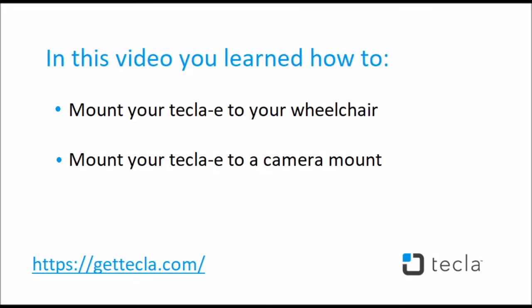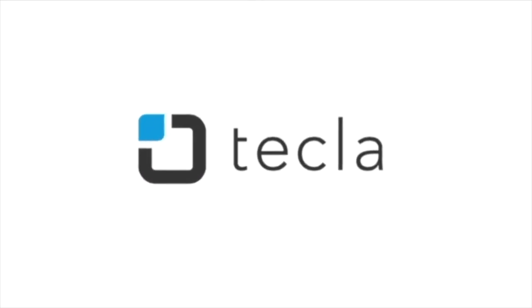In this video, you learned how to mount your Tekla-E to your wheelchair and mount your Tekla-E using a camera mount. Now you are ready to start using your Tekla-E. For additional settings or recommended configurations, please visit our support page at GetTekla.com.